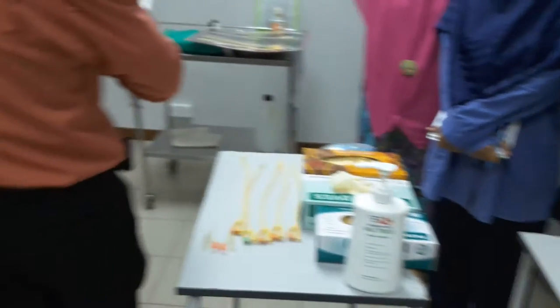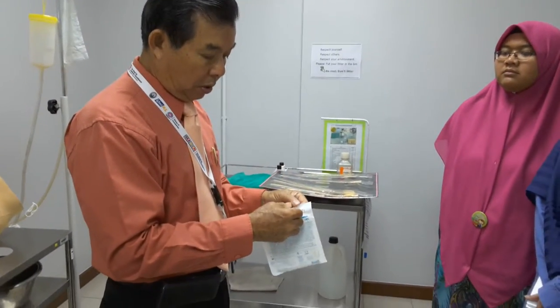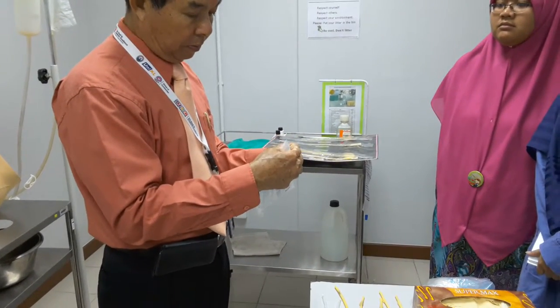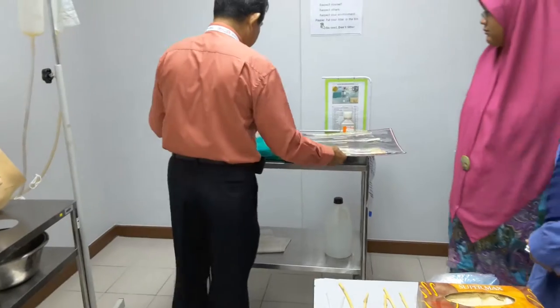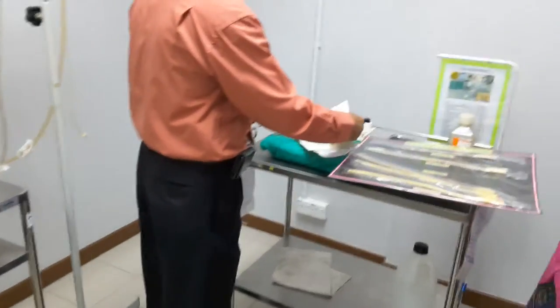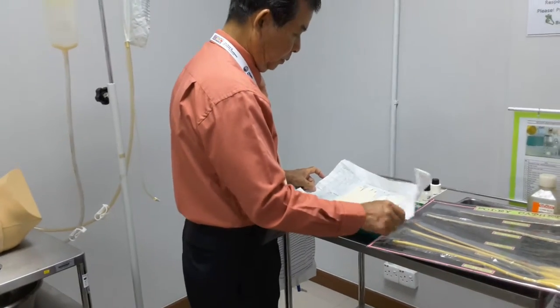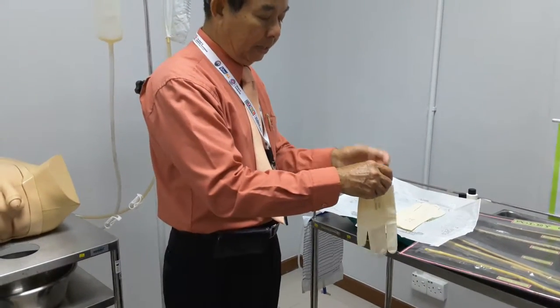I'll use size seven and a half — the bigger one is easier for me. Assuming I have already washed, scrubbed, and dried up, I open up the packaging. I have to use a non-touch technique — I'm going to use my left hand to open up, because these parts will be under cover.